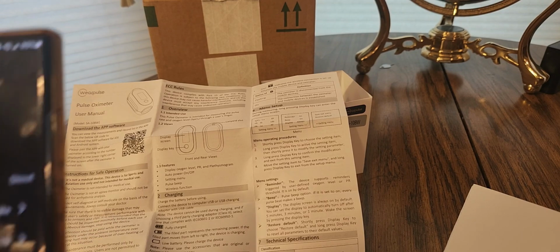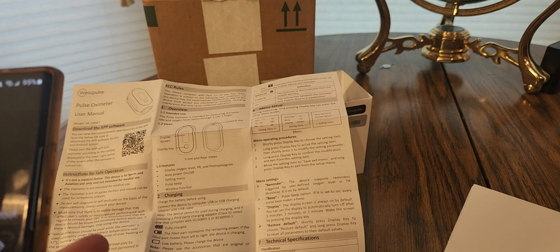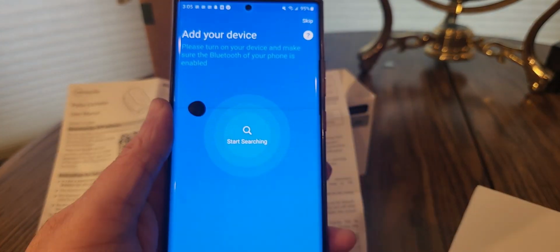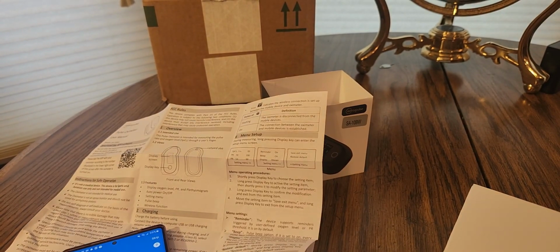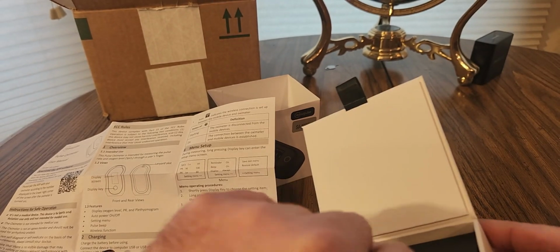You can put kg, pounds. We'll set it for pounds because we're sure on this big one. Okay, and then now it's going to ask you for the device. We have to show the device now. It should be fun. There we go.